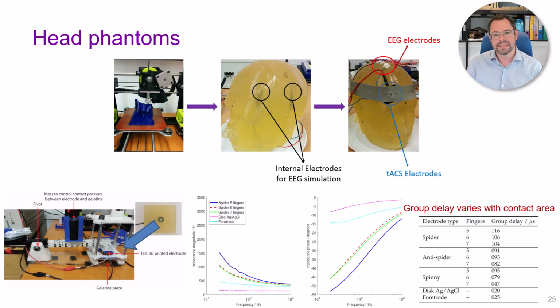The head plays out some pre-recorded EEG from the internal electrodes. We can then do real-time processing on that, and we can do everything without actually having a person in the loop. And so we can do some of the testing and development much more quickly. Again, I see this as a very important and timely area of future development for EEG.